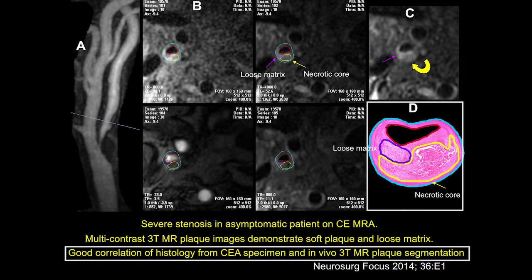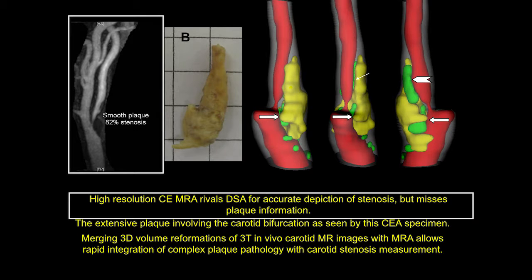And then what we did, I participated in a multi-institution histological validation study that showed that this area that's dark on T2 and didn't enhance on post-contrast T1 corresponded very nicely with histologically validated necrotic core. So when we say dark on T2, non-enhancing area is necrotic core, we have histological proof behind us.